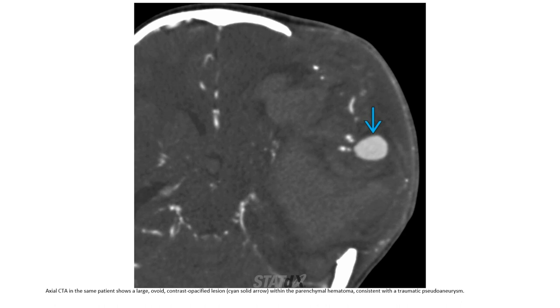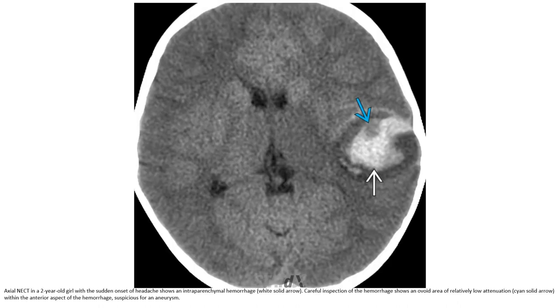This is the CTA in the same patient, showing a large ovoid enhancing opacified region within the parenchymal hematoma, consistent with a traumatic pseudoaneurysm. Non-contrast enhanced CT in a 2-year-old with sudden onset hemorrhage shows intraparenchymal hemorrhage.